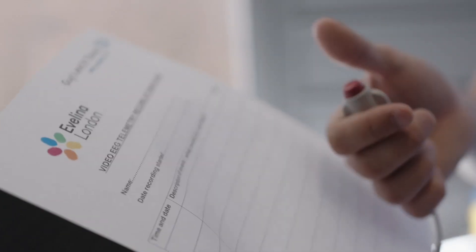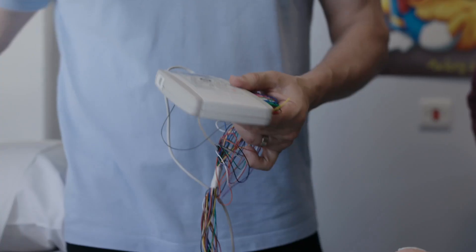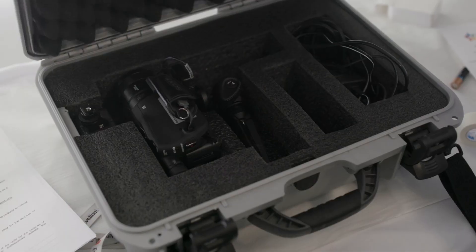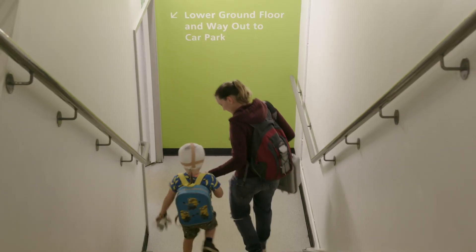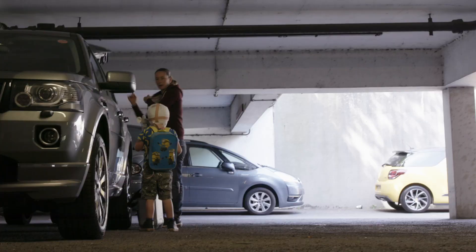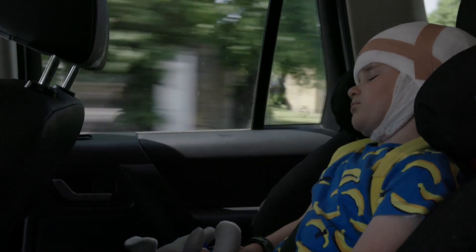We show you how to press a button and fill in a sheet if your child has an event. You will have a small recorder which goes in a bag and a camera which goes in a protective briefcase. They give you a number that you can call if you get stuck or you're not sure about something, and a lot of information on how to do it as well. That really helped for me, just in case something went wrong.